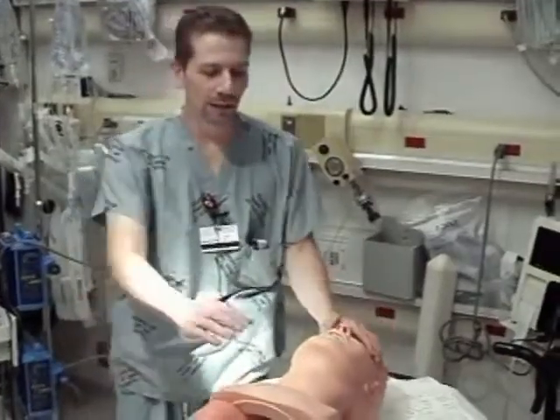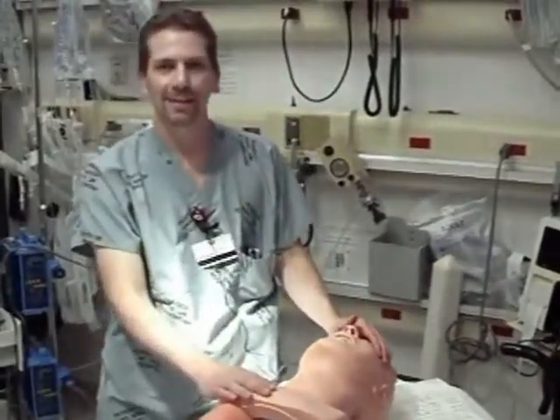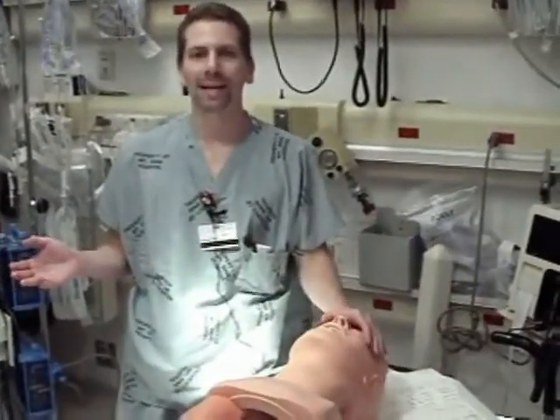Hey folks, we're back in the Elmhurst Trauma Room. We're going to do a second instructional video by James Nishi and myself. Today what we're going to talk about is the skills of laryngoscopy. We're not going to talk about airway management in terms of drugs or in terms of sequencing. We're just going to talk about laryngoscopy itself.